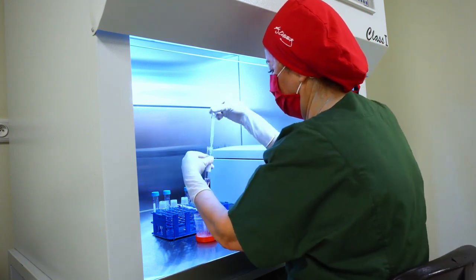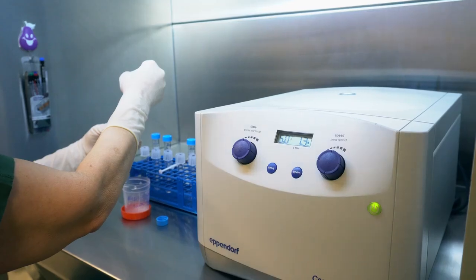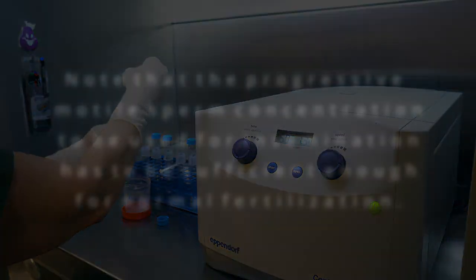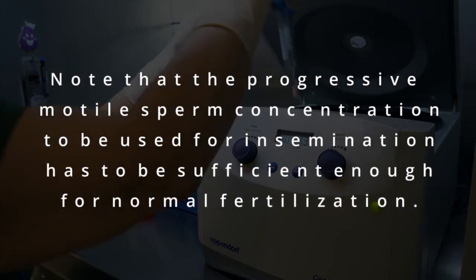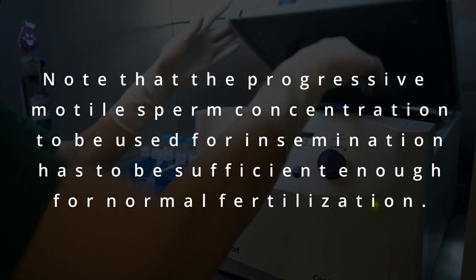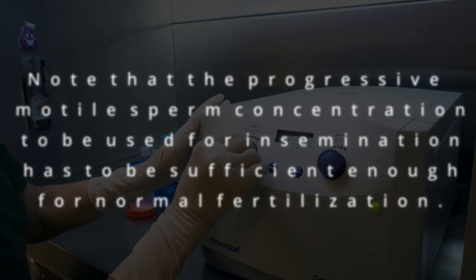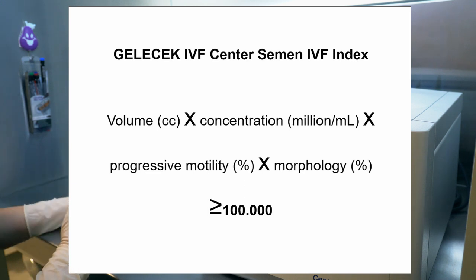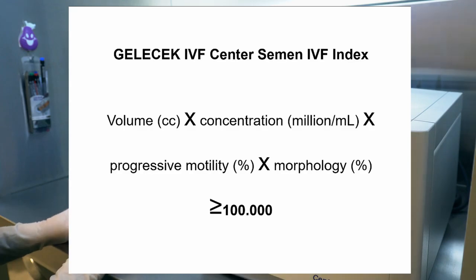After preparation of the semen sample via density gradient technique, sperm concentration with progressive motility is defined. Note that the progressive motile sperm concentration to be used for insemination has to be sufficient for normal fertilization. In Gelecek IVF Center, a cutoff index value of 100,000 is defined for progressive sperm cells with normal morphology.